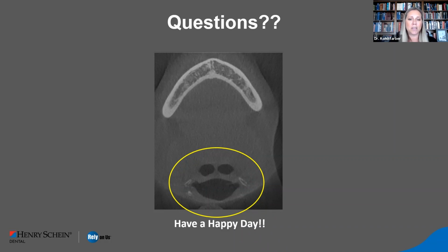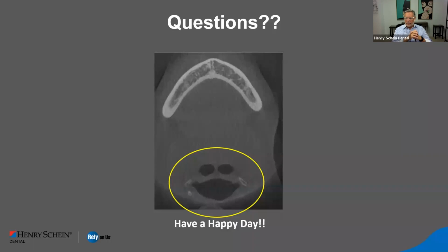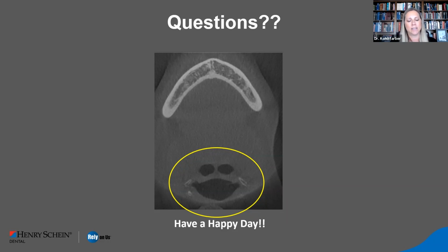Probably not, but if they feel they need it, again, it comes down to the clinician's judgment in their office at that time. Okay, good. So if you need to take a CBCT pre-graft in order to determine if a graft is even needed, would you still take another one once the graft has osseointegrated? Yes, the answer to that one is yes.